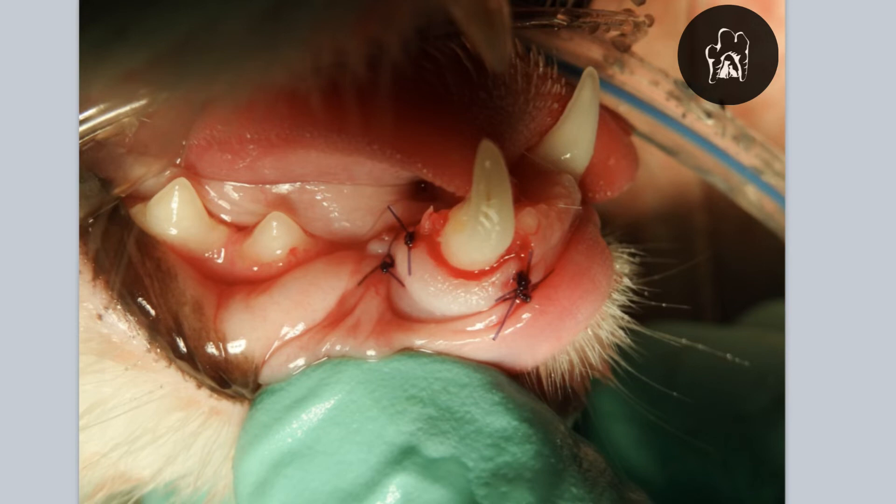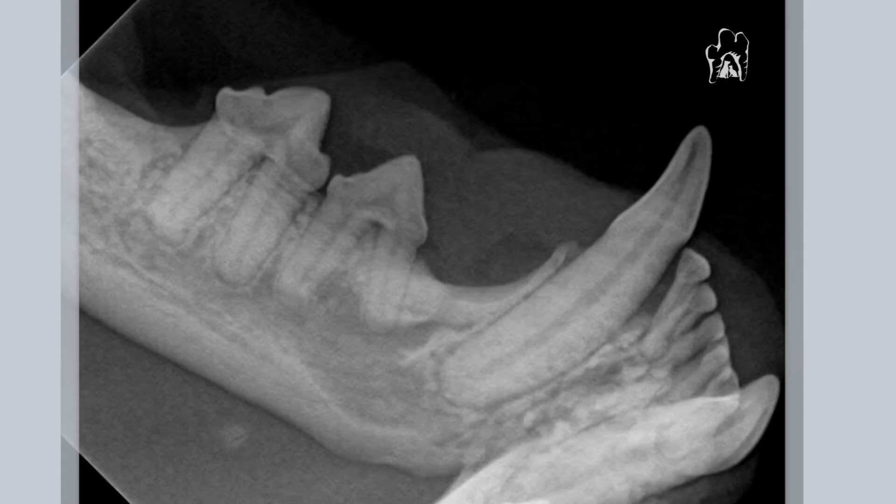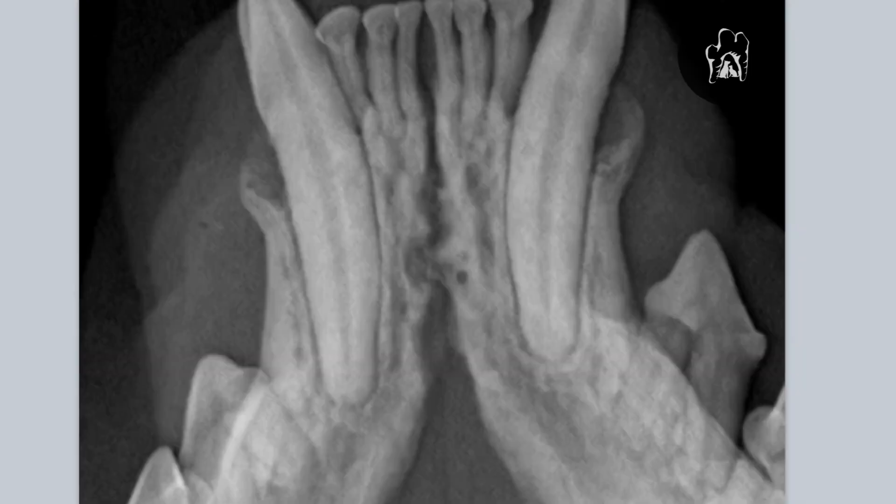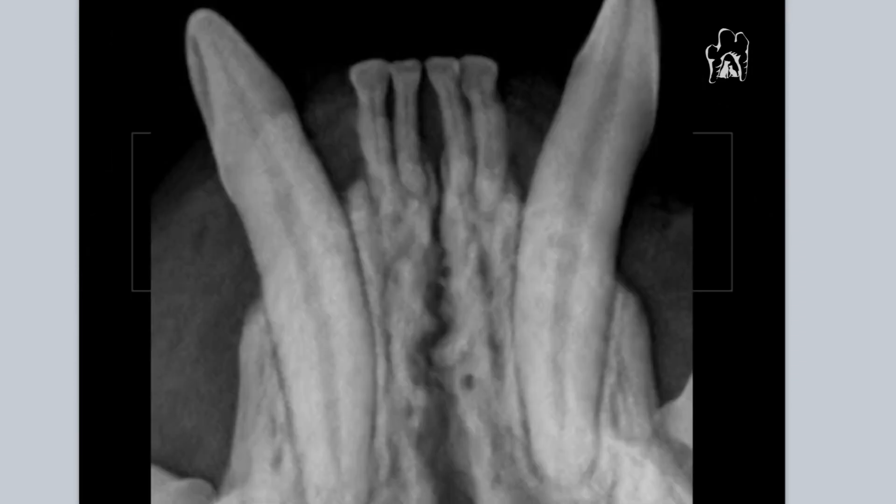We've exposed that root there grossly and then sutured that gum down a little bit further. There's what it looked like before radiographically, there's what it looks like now — before and after.